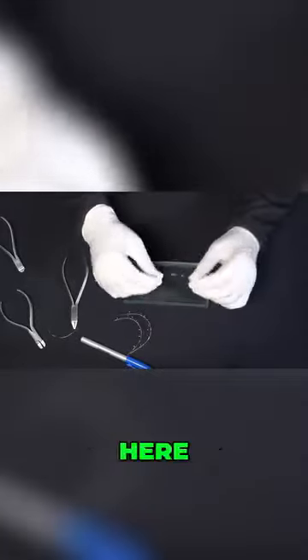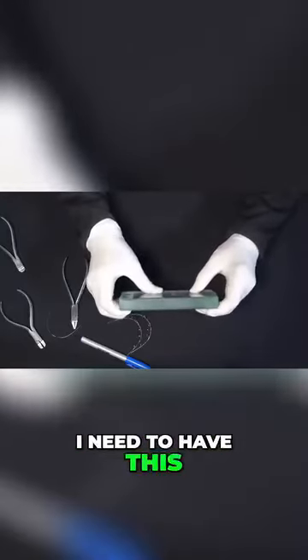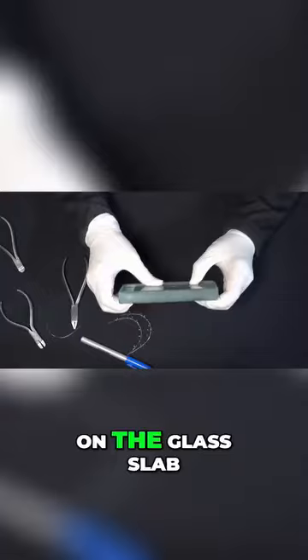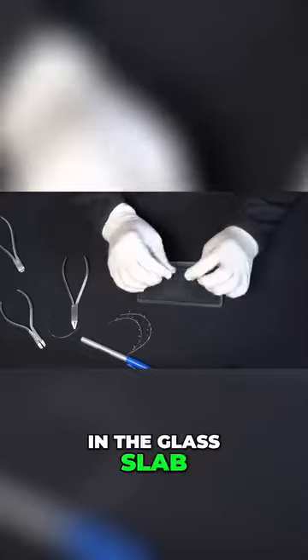I will show you what we call here in Brazil the fish mouth. When I do this, I need to have this. The anterior segment of the wire is not flat anymore — it's not completely flat on the glass slab. That's why I use the glass slab: I want to put the wire completely flat on the glass slab.